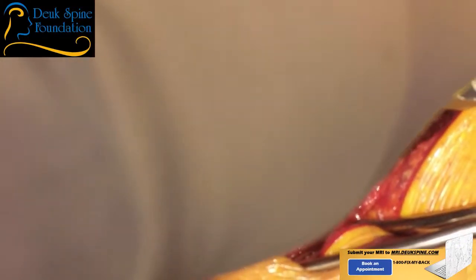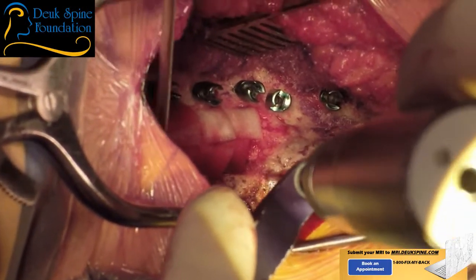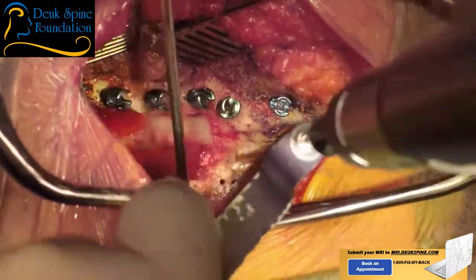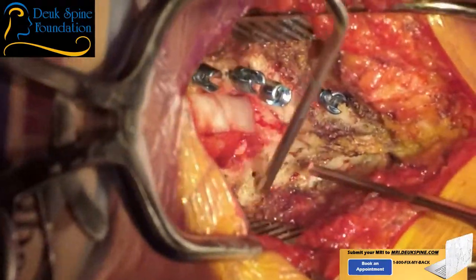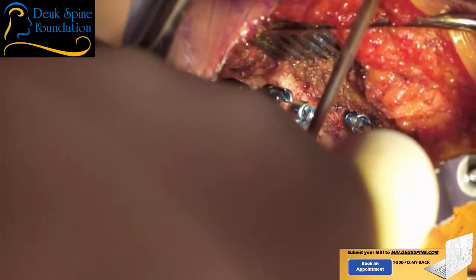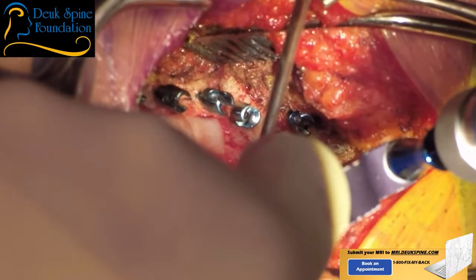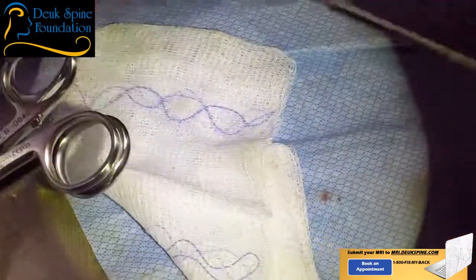Up and out, 20. C7 again, very difficult to do, but you can get it just right. And then T1 and T2. See how it grabs and pulls? How's our waveforms? Yeah, nice. Perfect. Both are in the pedicle. 16. You can feel it.